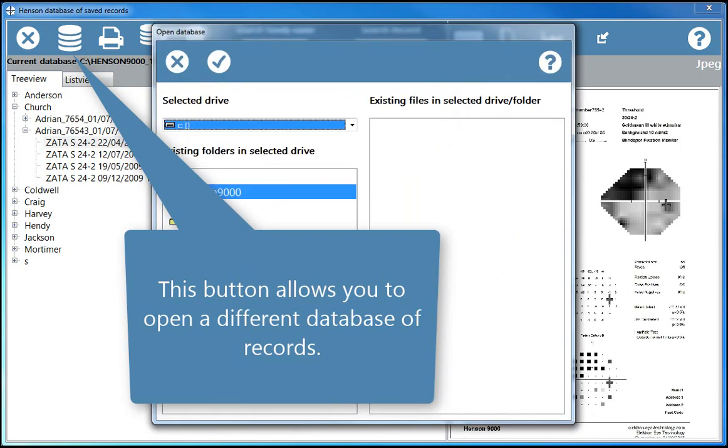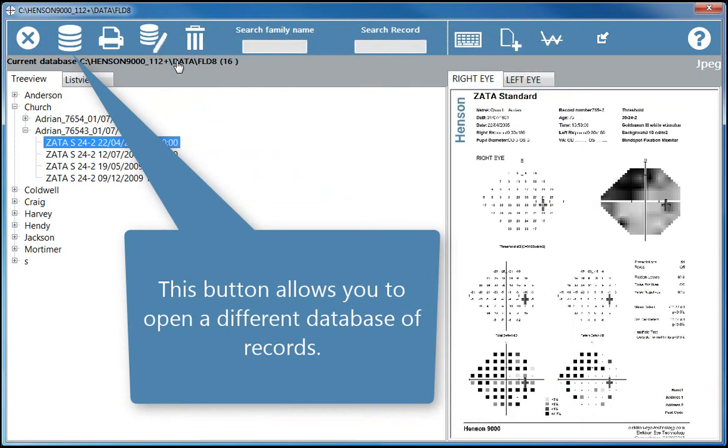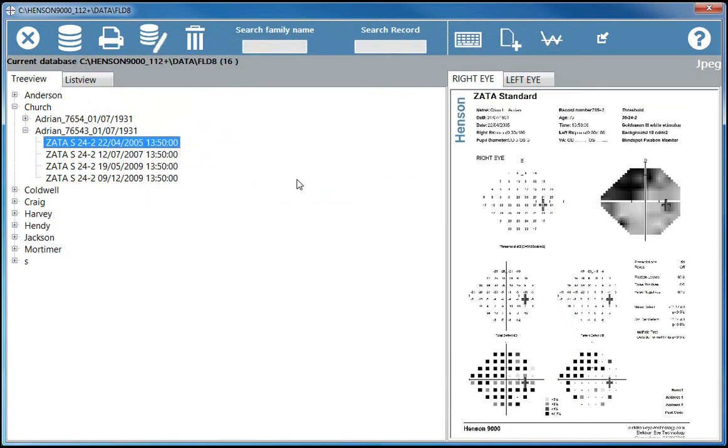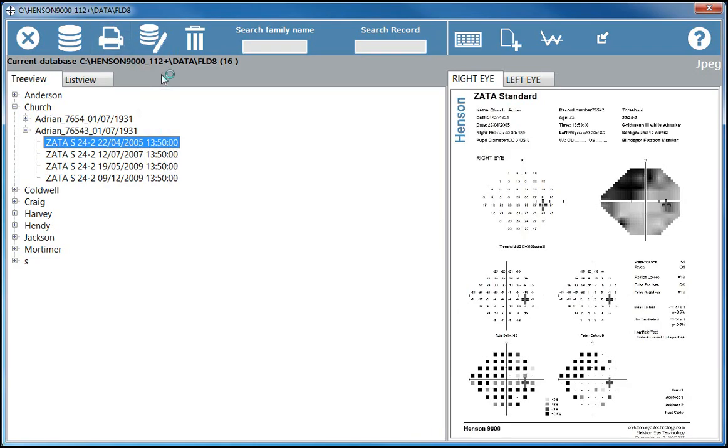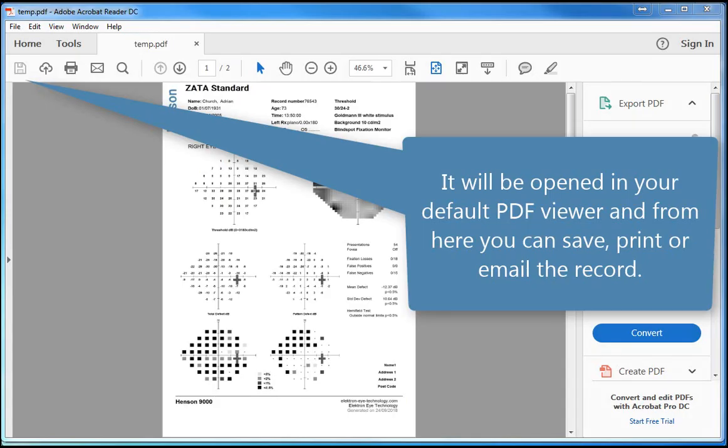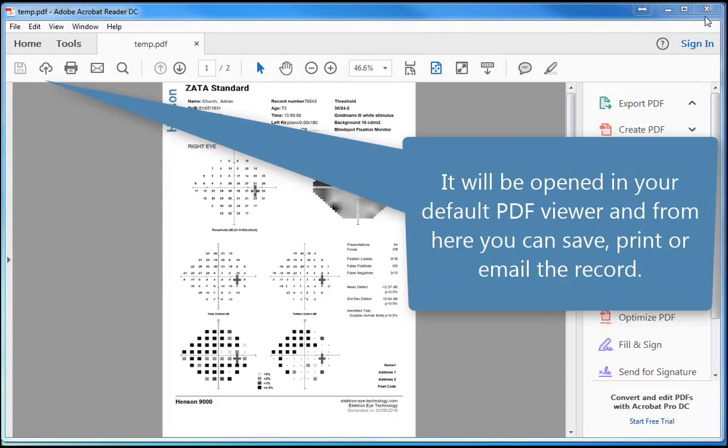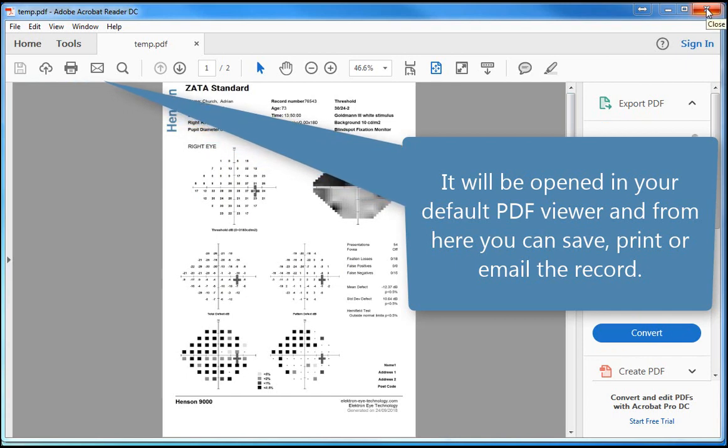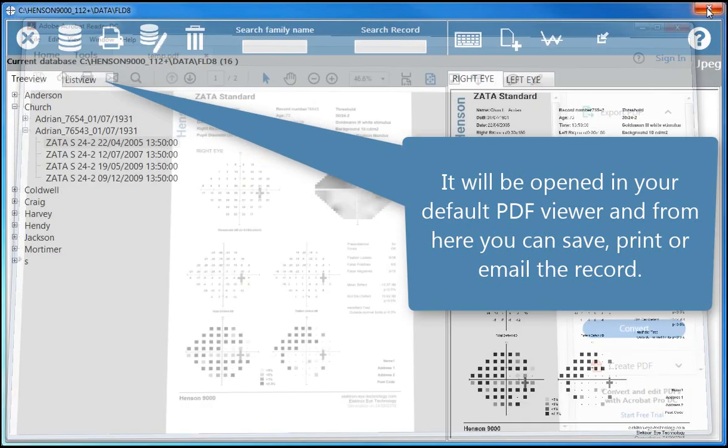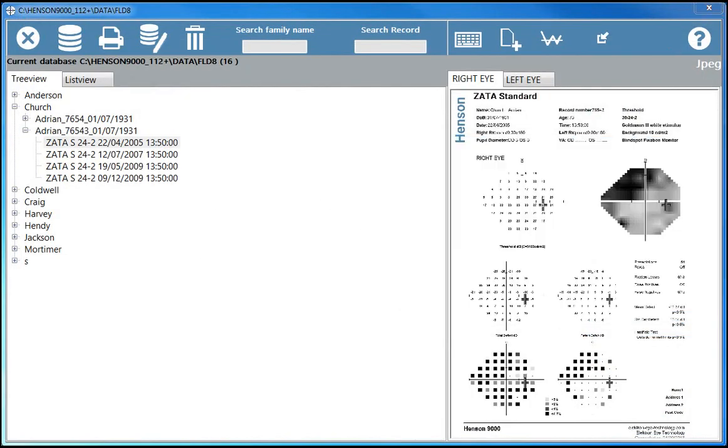This button allows you to open a different database of records. The currently displayed record can be printed by clicking the printer icon. It will be opened in your default PDF viewer and from here you can save, print, or email the record.